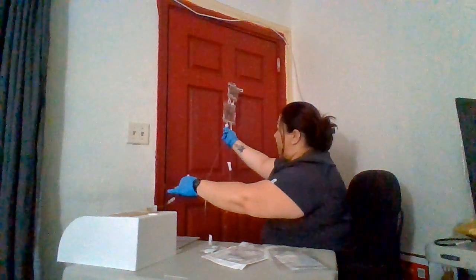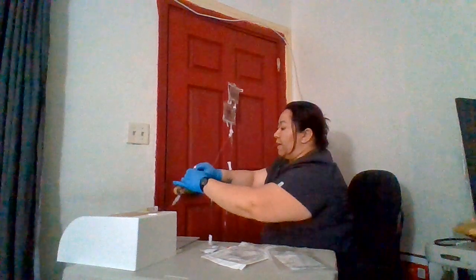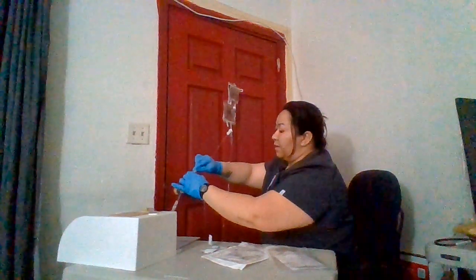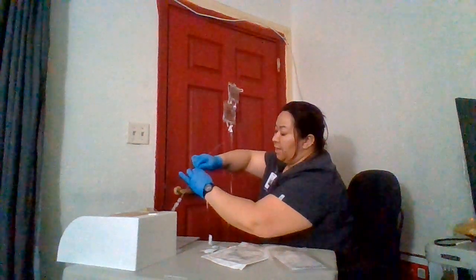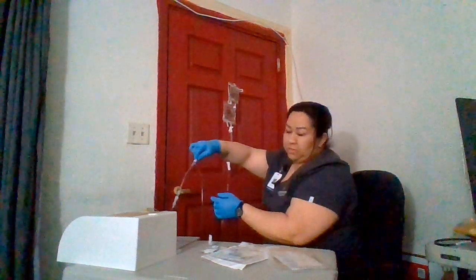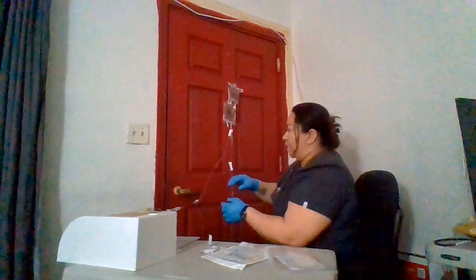Okay. My secondary tubing has been primed, and I'm closing it now. My Y connector is clean and ready to be used. Okay. So it's attached to the Y connector now.